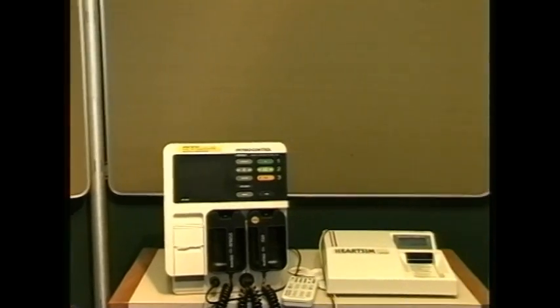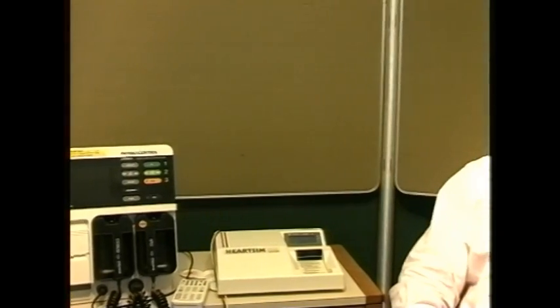To help us with some of the abnormal rhythms today, we've got David Miller with us, who's our resuscitation training officer. He's going to show us how we obtain a normal three-lead ECG trace. Good morning.